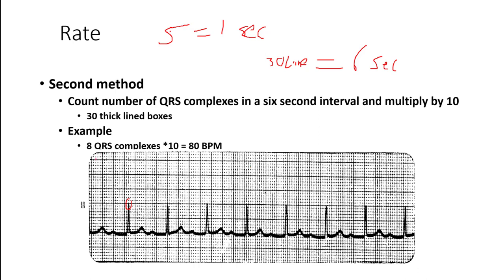In this example, we count 30 large boxes, then count the number of beats that occur in that six-second interval. We count eight QRS complexes. Eight complexes in a six-second interval — extending that out to 60 seconds or one minute — gives a heart rate of 80 beats per minute.